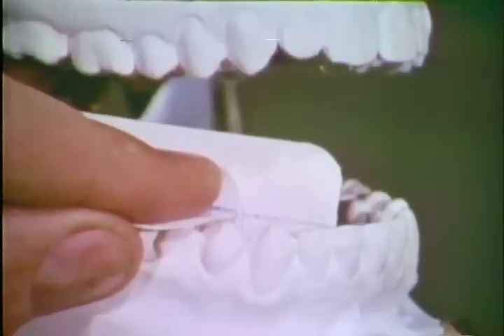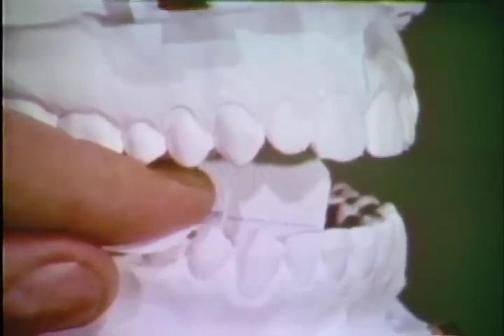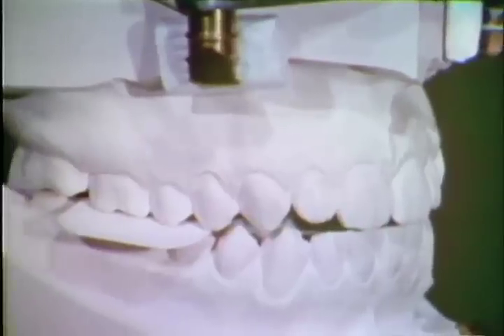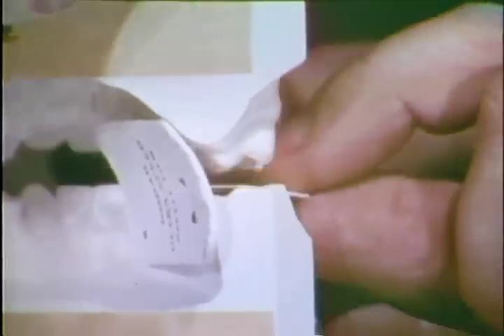With the film properly positioned, the patient is asked to slowly close. The examiner maintains the position of the packet with his index finger, carefully sliding it out of the way at the last possible moment. The packet position has been maintained, and the film would now be ready for exposure. We now view the same procedure from behind the models: the horizontal insertion, rotation into position, maintenance of position during slow closure, and now ready for exposure. Removal of the film is merely a reversal of the procedure.